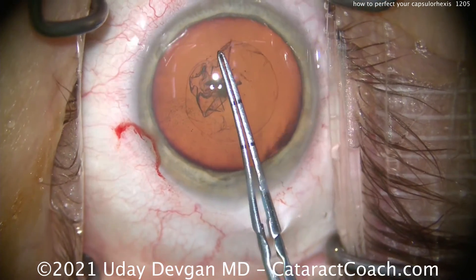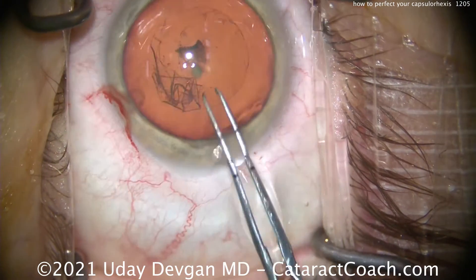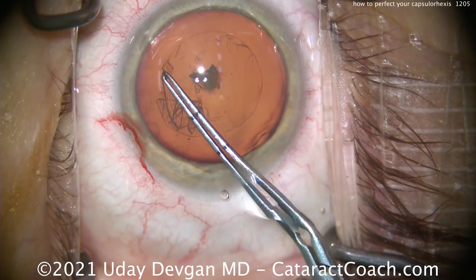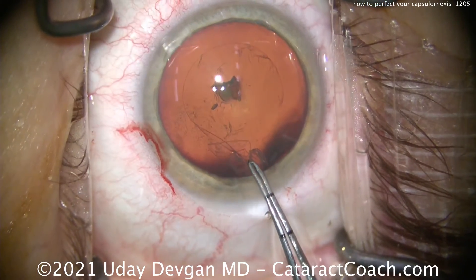The key is going to be at the very end here. Now here's where your temptation is to just pull centrally and be done, but don't. Continue the curve and look at that edge there — we want to continue that tiny little edge to make it as perfect of a circle as possible.